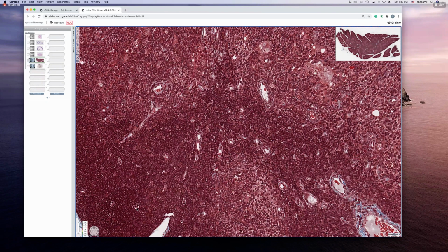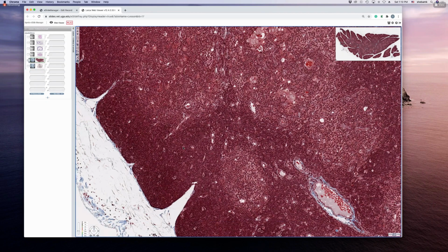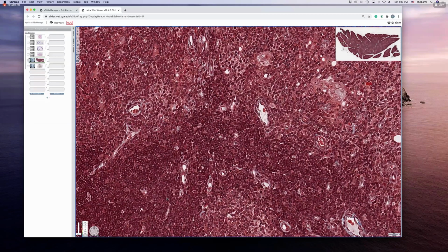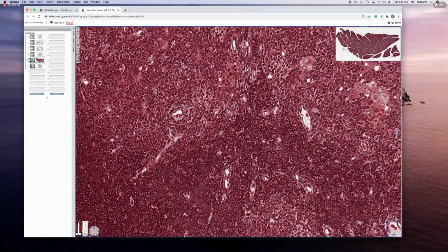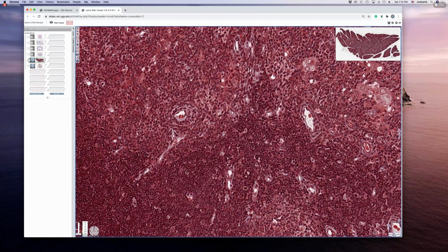So who are all these cells sitting in these spots that look like a starry night, stars in the sky? What do they contain? Macrophages. Macrophages, very good. Those are the different cell types present in the thymus. So how do these thymocytes come in? They come from the bone marrow, but how do they get into the thymus?